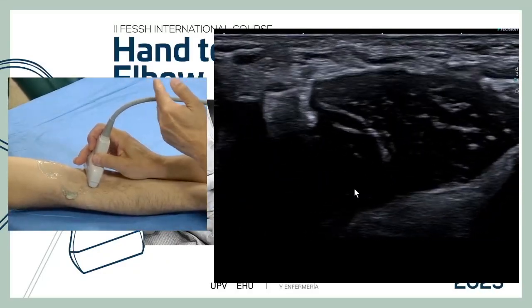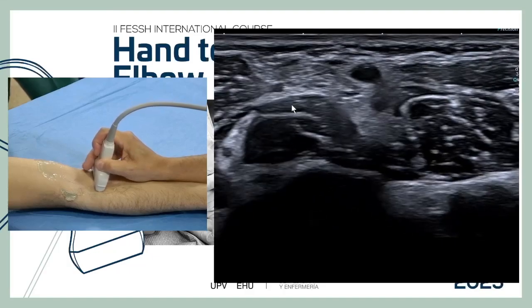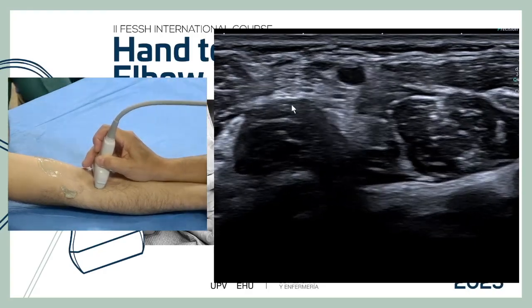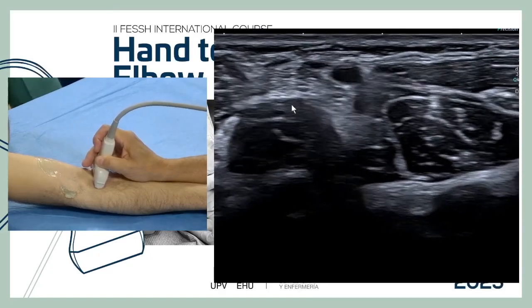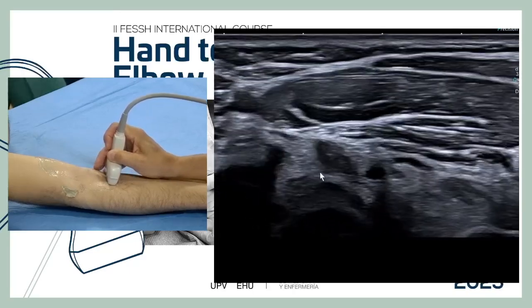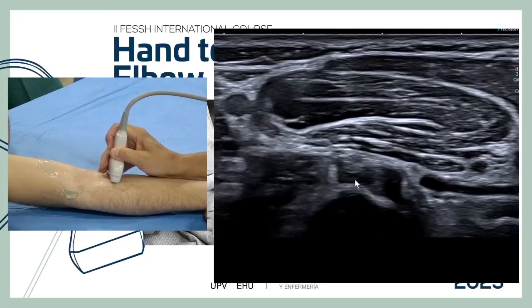If there is a rupture of the biceps, in the short axis we simply move down until we lose the tendon. About 50% of ruptures are complete ruptures that displace proximally. Moving from proximal to distal in the short axis, we can clearly see if the tendon is ruptured and identify the stump. For partial ruptures, we must check carefully at the radial tuberosity.